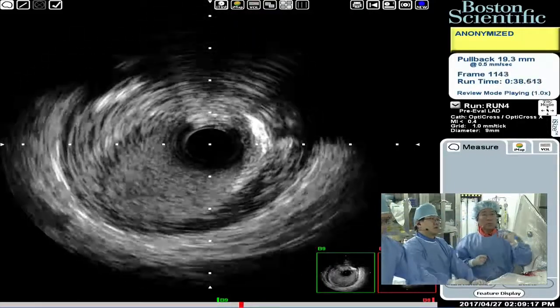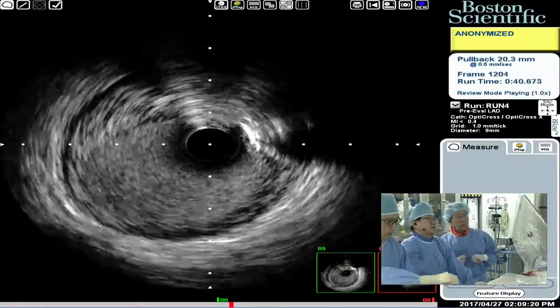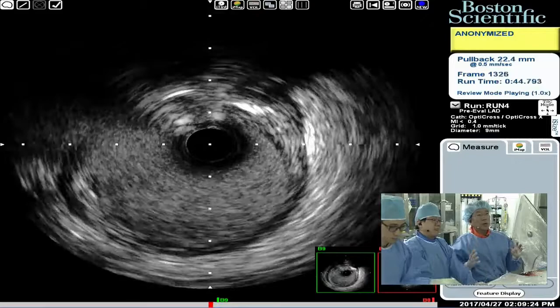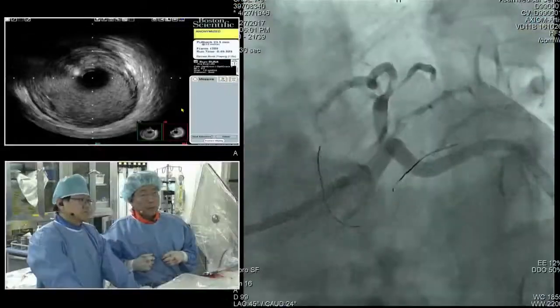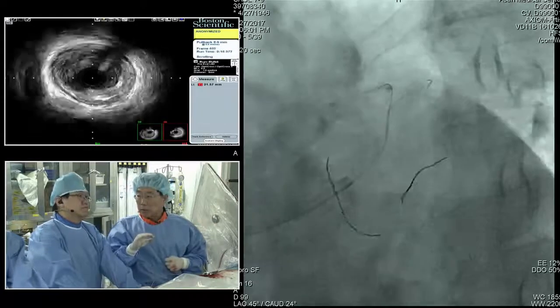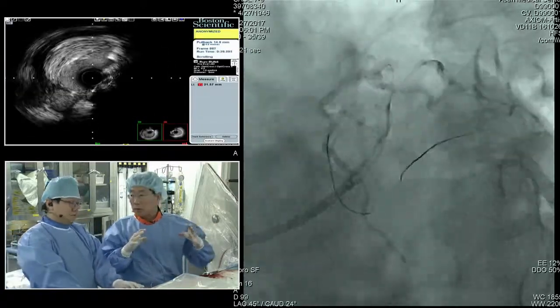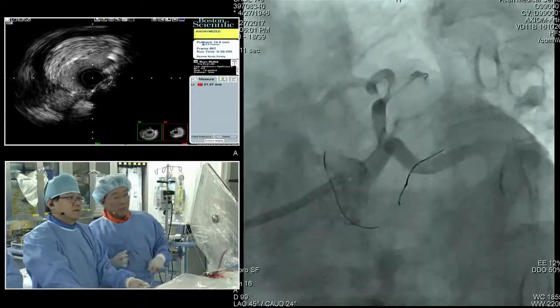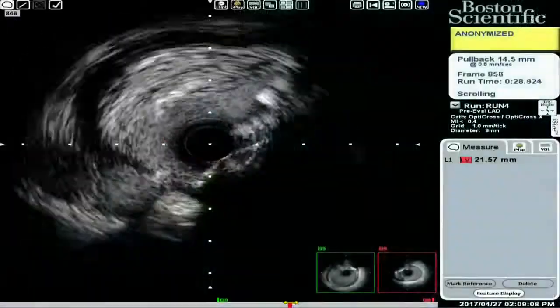And then we have already seen the proximal part, right? Yeah. Mainly soft plaque for LAD, and we've learned quite different findings. The diagonal branch is relatively big, rather than we expected. Would you show us again the diagonal long, the very ostial part?